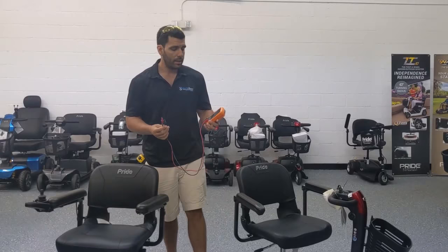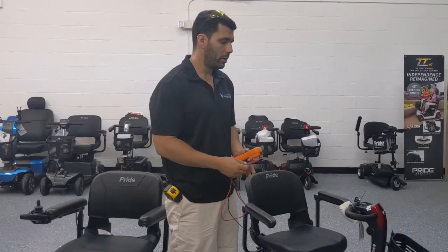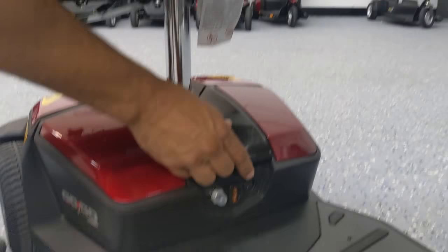I'm going to show you how to actually test your batteries without even having to take apart the battery box and expose your batteries. The way to do that is by using the charging port. If you look here on the right side there's an XLR charging port — that's where your charger plugs in. There's another one here on the actual battery box and you can use that one too.